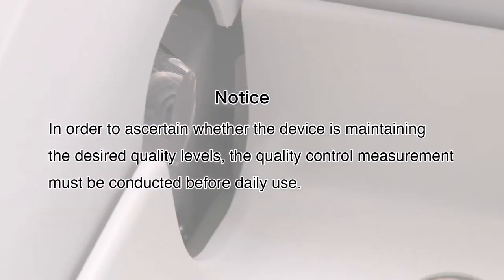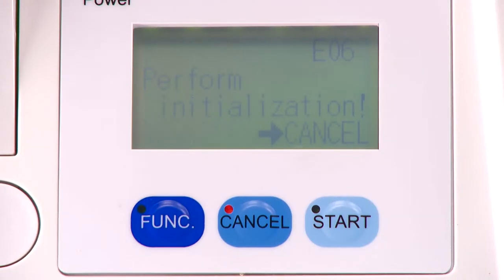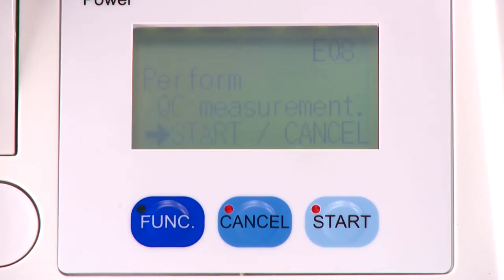In order to ascertain whether the device is maintaining the desired quality levels, the quality control measurement must be conducted before daily use. Once initialization is completed, the prompt for the quality control measurement is displayed on the screen.